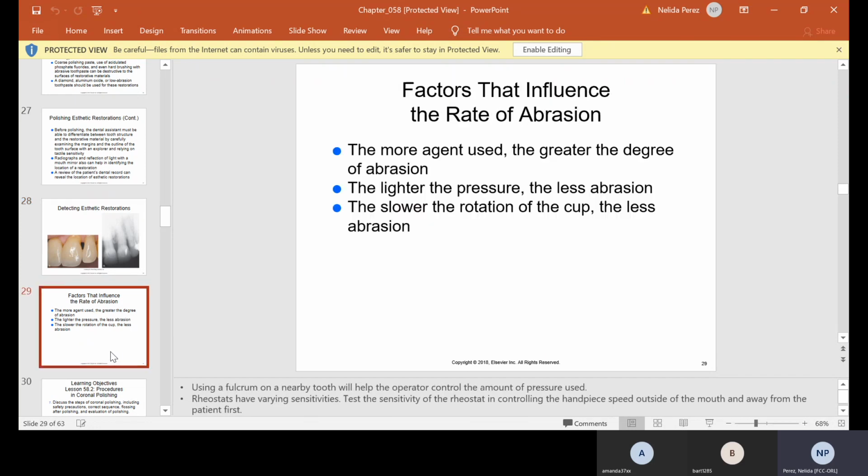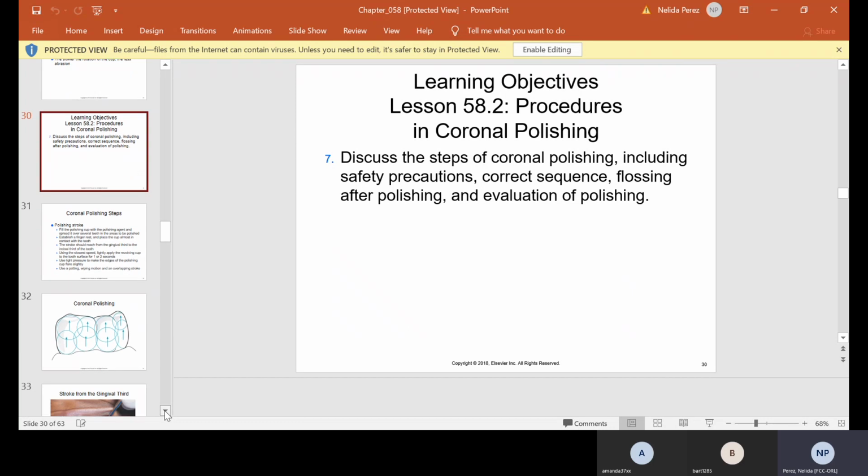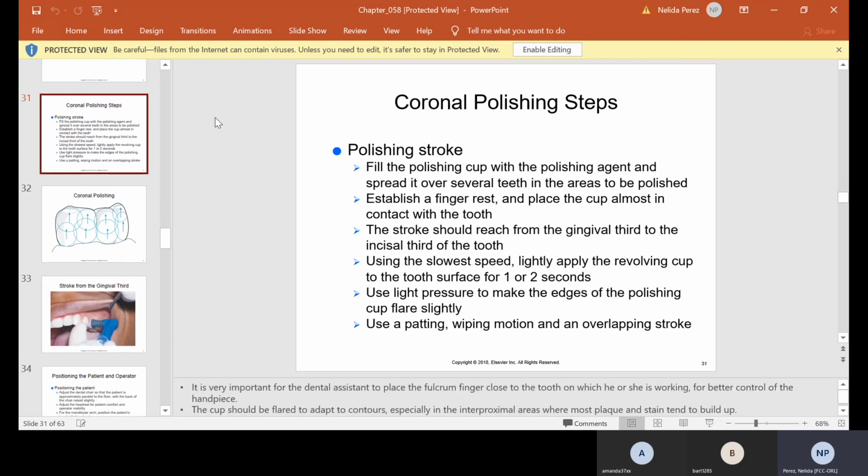So again, be careful. Factors that influence the rate of abrasion: the more agent used, the greater the degree of abrasion; the lighter the pressure, the less abrasion; the slower the rotation of the cup, the less abrasion. So, basically, the harder you do it and the more you do it, the more that you're taking off the tooth. The less that you do it and the less that you use, the less you're hurting the tooth. So we're going to discuss the steps, and they start with the strokes.